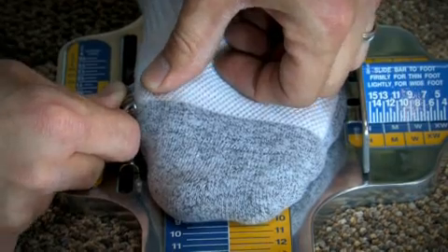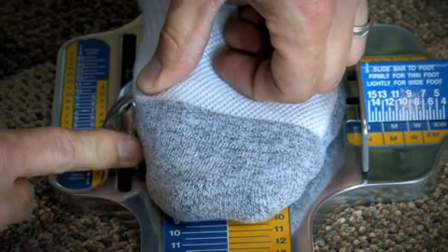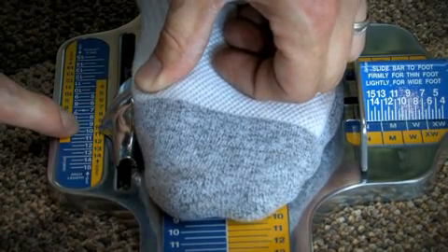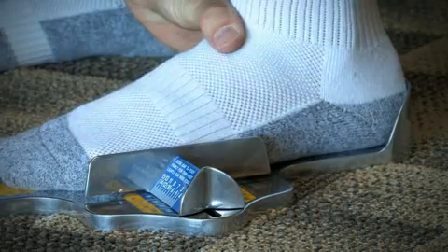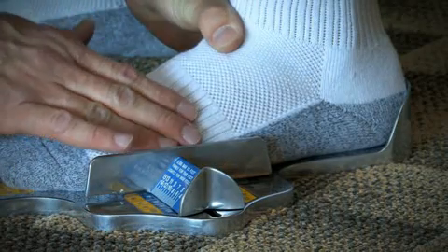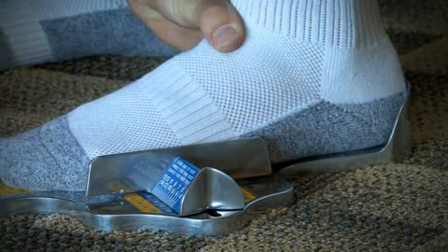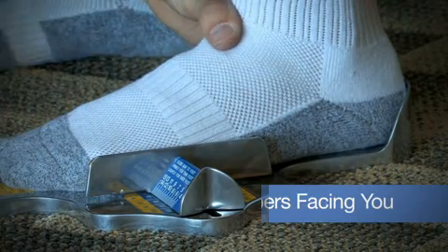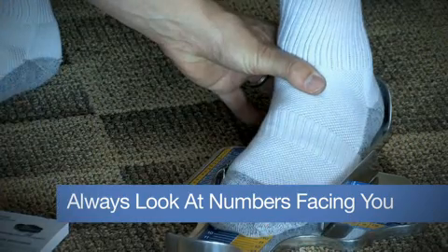We take the sliding bar, again, matching up the center of that sliding bar with the center of his bunion, and we get that he's measuring a 10 as well. Once we push the sliding bar over, the 10 just barely touching the outside there, and then push down just a little bit, we see that he is measuring a 10 medium. Again, we're always looking at the numbers that are facing us. Because he's a gentleman, we're looking in the blue.